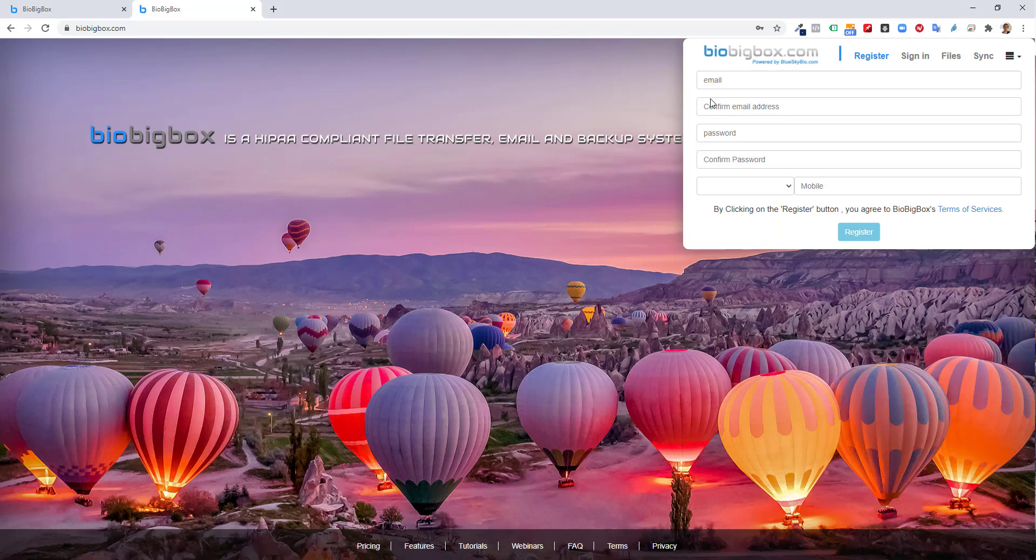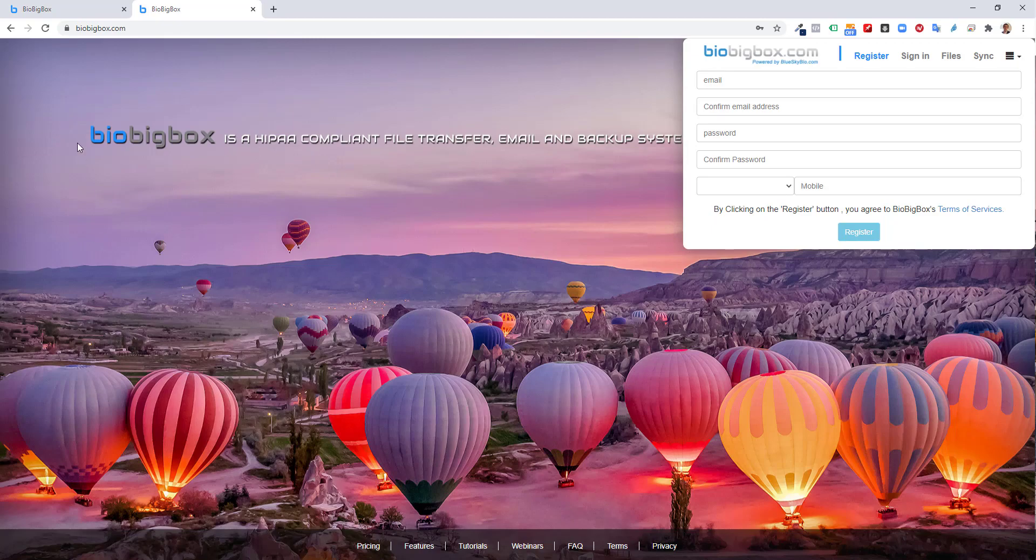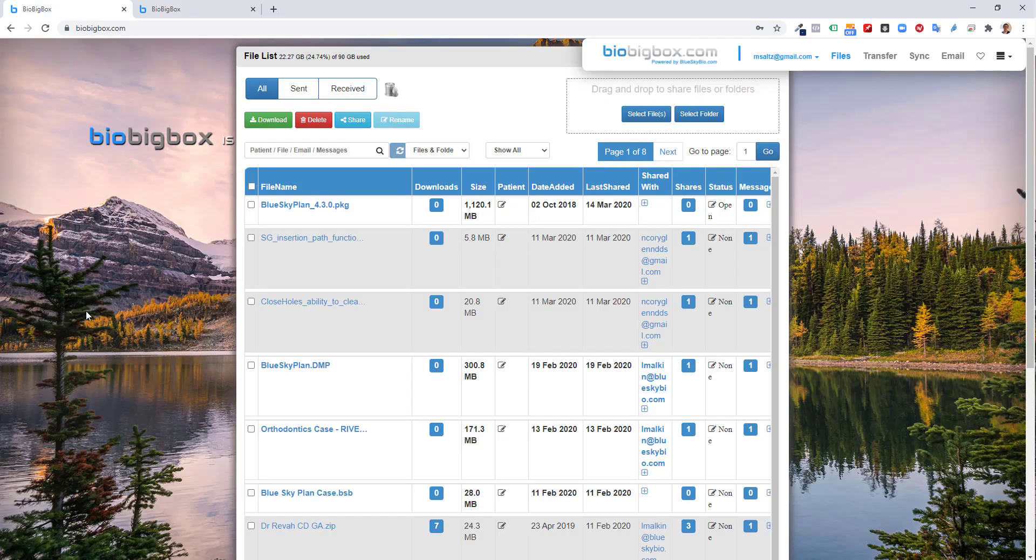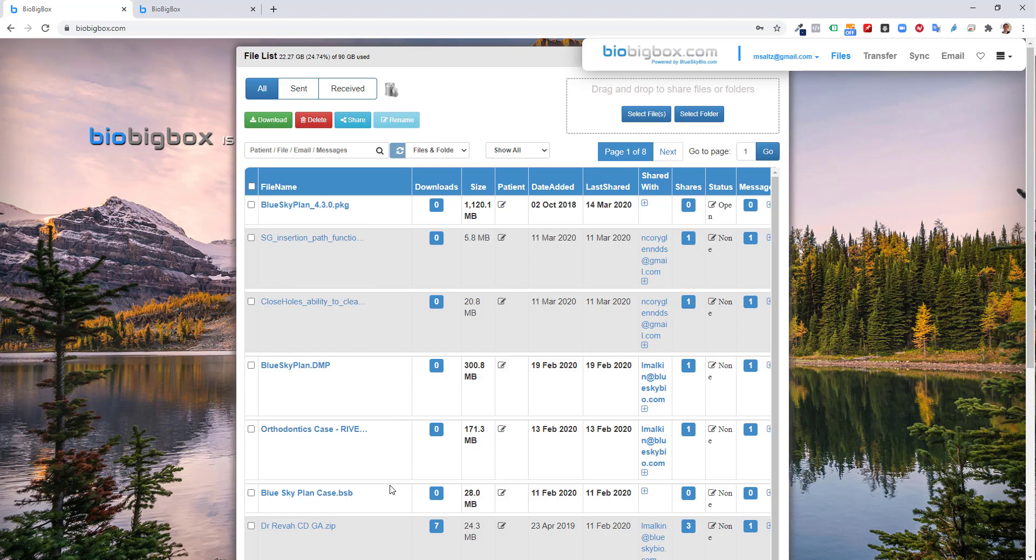Setting up an account is just putting in your email address, creating a password, and entering your cell phone number. You click the registration button, and you're good to go. Here we see my account. I'm logged into msaltz@gmail.com. These are my files that I've already uploaded and or shared with other users.